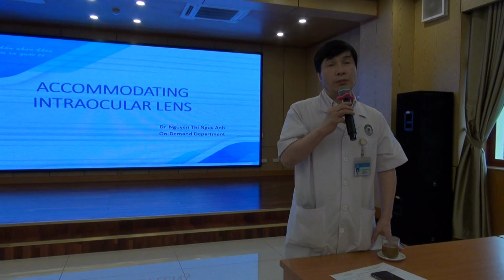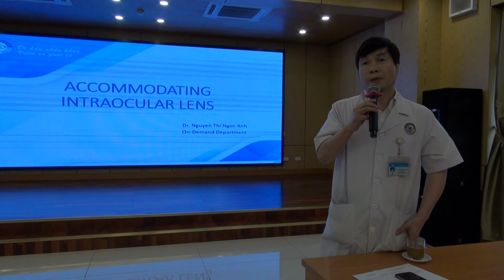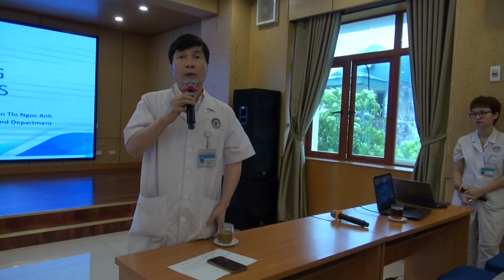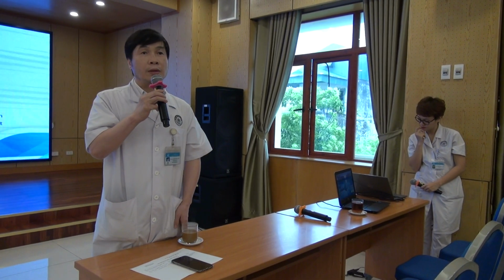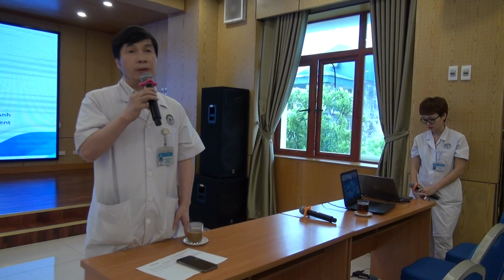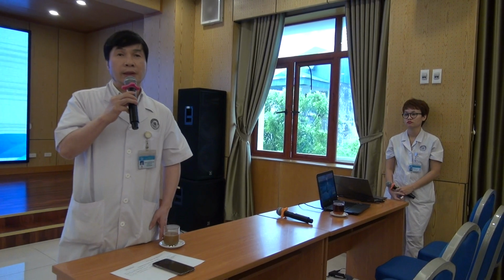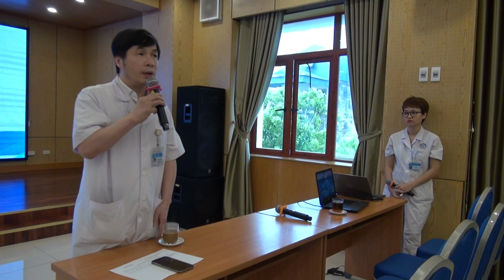Hospital. We use monofocal IOL, and we can also use multifocal IOL. And in some cases with astigmatism, we can use toric IOL. But nowadays there's a very modern technique, the accommodating IOL, which is often used in other countries, and also in Hanoi or Ho Chi Minh City, where some doctors have already used accommodating IOL.